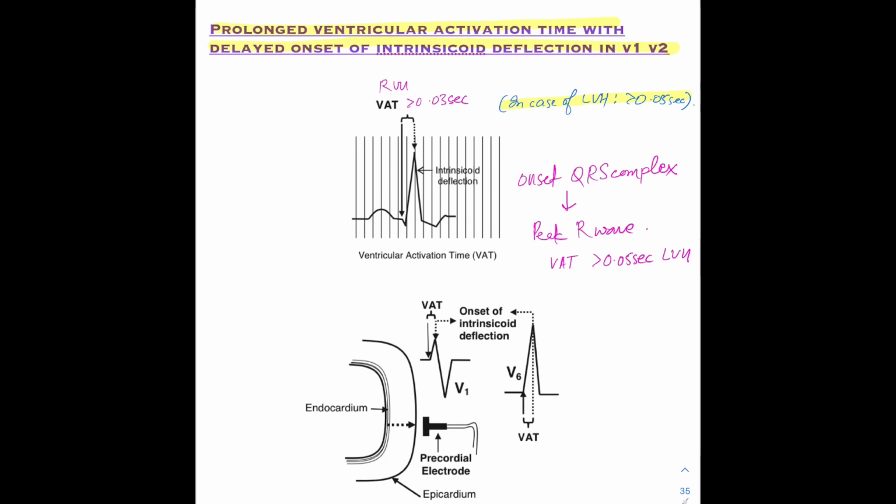So what is ventricular activation time? Just a quick revision. It's the time for the impulse to travel from endocardium towards the epicardium and then hit the electrode.